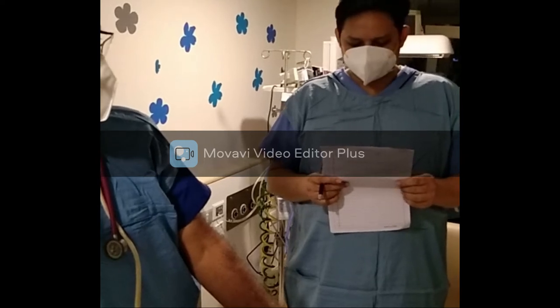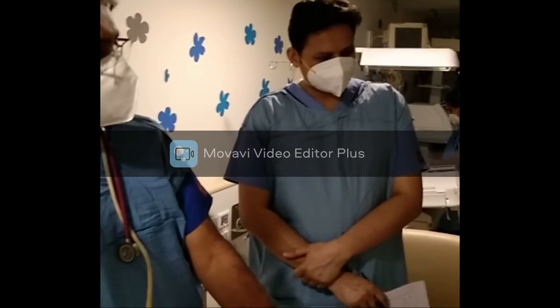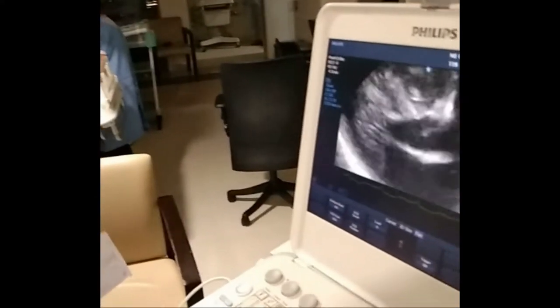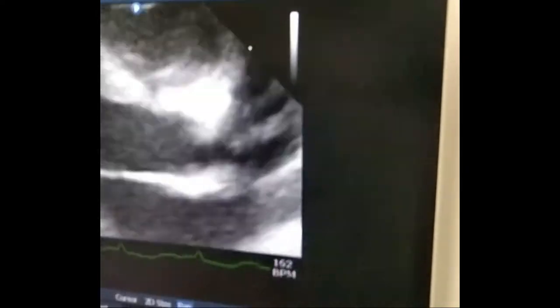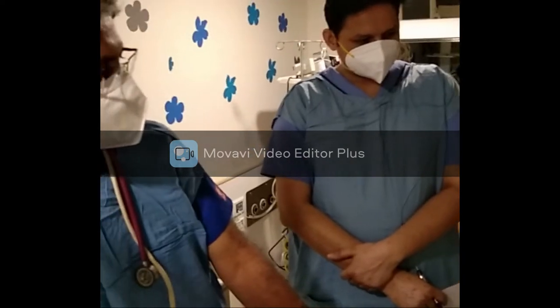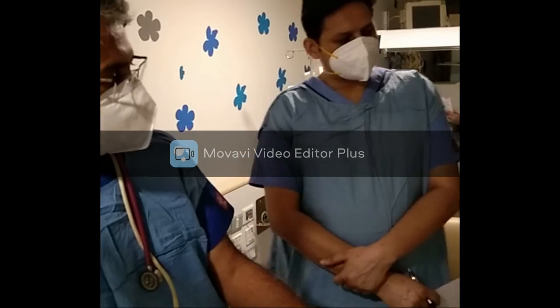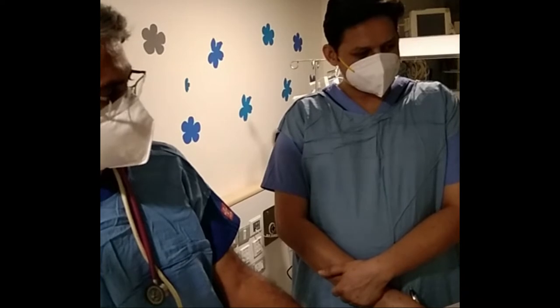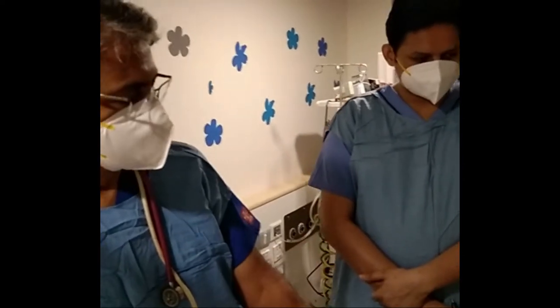What are the parameters to derive left ventricular function? There are many echo parameters that reflect ventricular function, especially of the left ventricle. But there are 6 important parameters you can derive on echo: ejection fraction using the parasternal long axis, ejection fraction using the parasternal short axis, and also the E-point septal separation on parasternal long axis. Each one I'm going to explain.